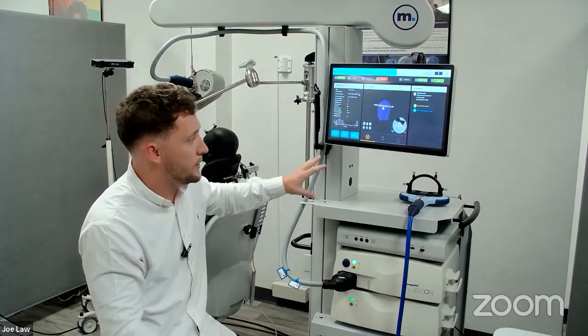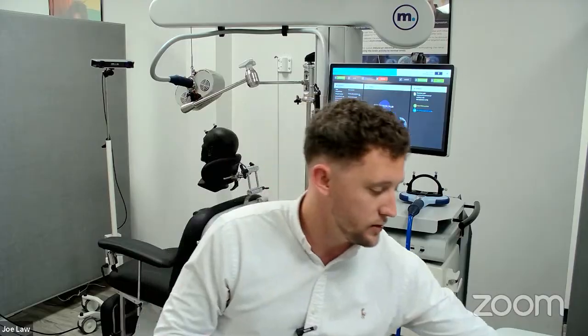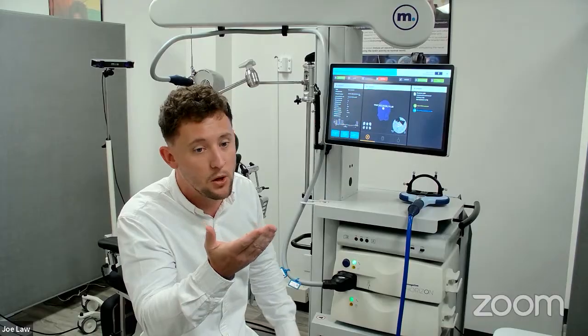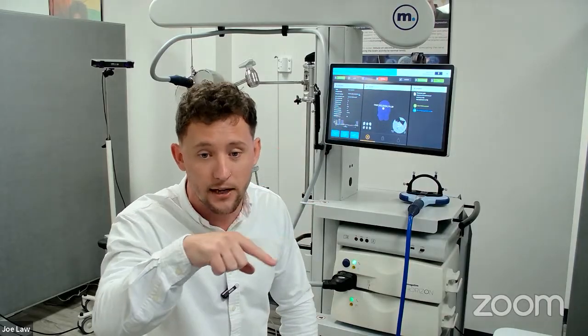What you can also do is plug in some EMG electrodes into the front of this system, and stick those EMG electrodes to the patient's thumb. That will pick up any muscle signals within that patient's thumb. So not only will you get a visual response, but any muscle response will get sent back through the electrode and will show up as a sine wave on your waveform. If there's no muscle response, the waveform will be flat. If there is a response, you'll see a nice sine wave on the screen. You can use them in tandem, that's not a problem.